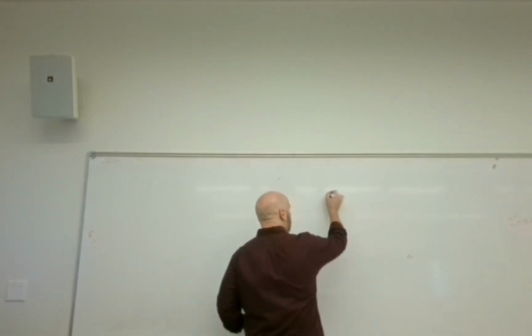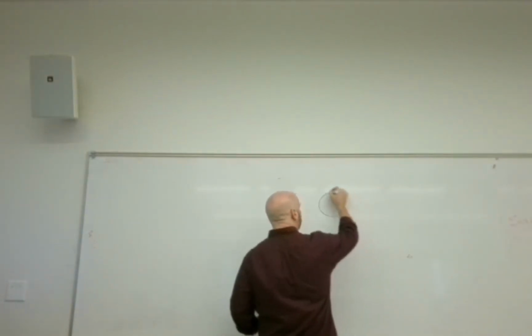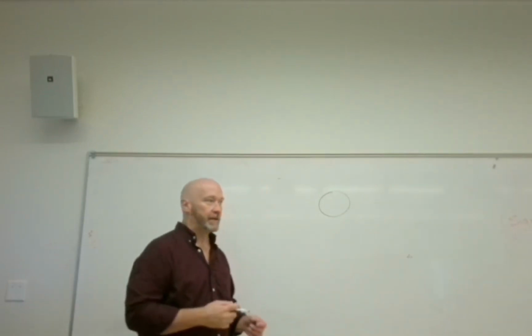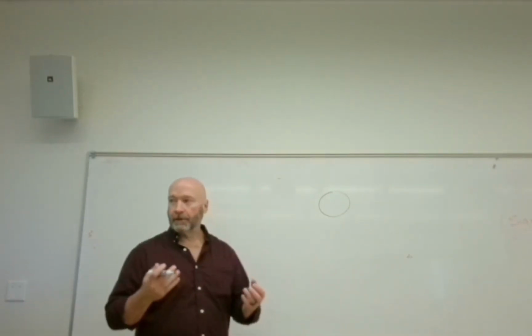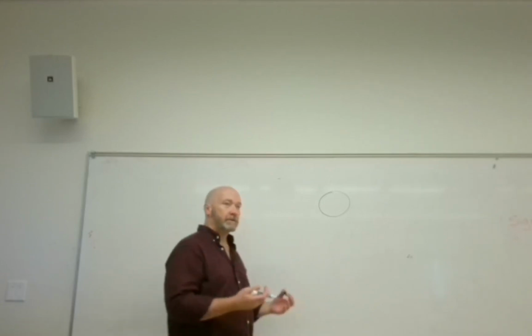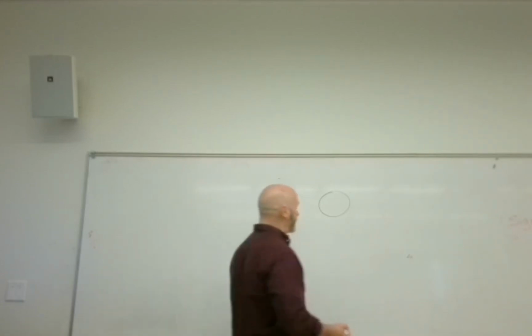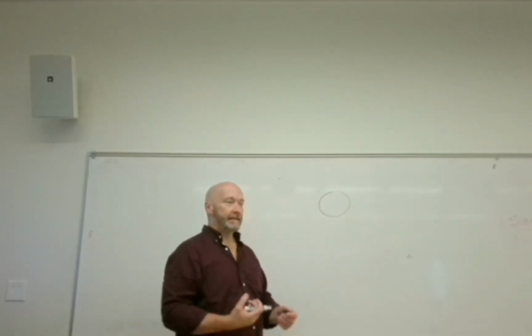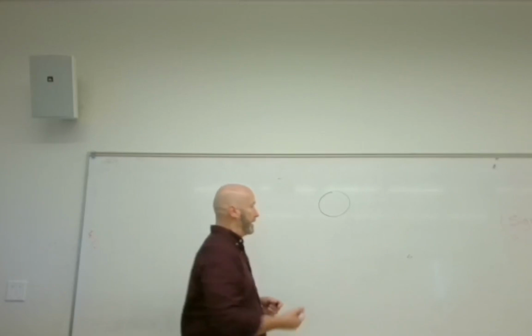The body is the thing on the x-ray that looks square. It's not. It's more cylindrical in shape. But remembering that we're looking at a two-dimensional thing, so it looks like it's a square, but that's the body. The disc sits on top of the body, and that's the only place that you have a disc. You don't have a disc anywhere else, right?